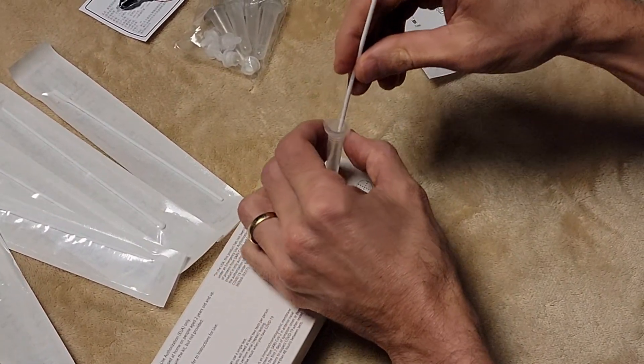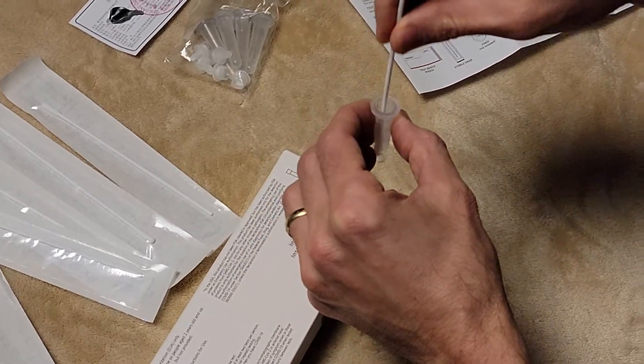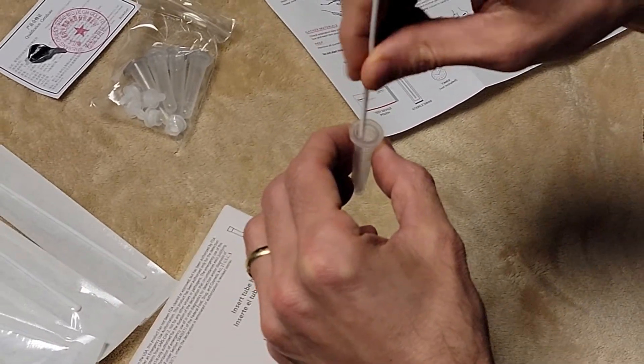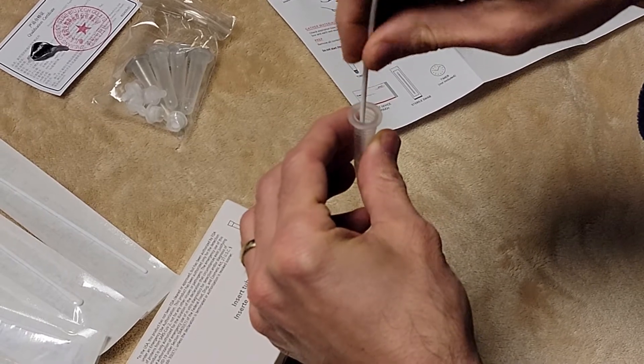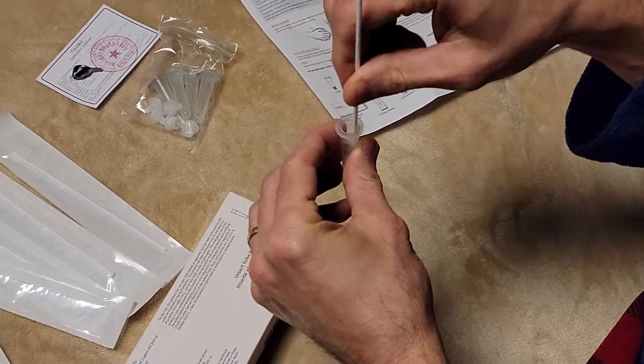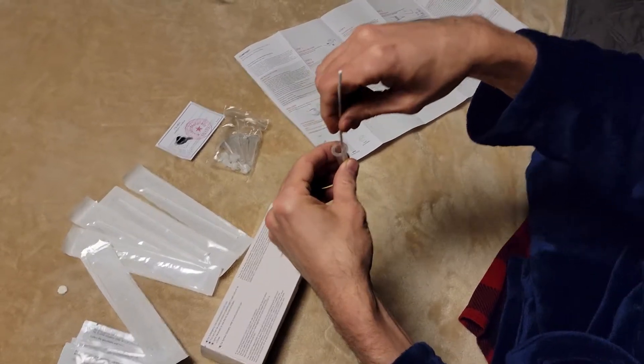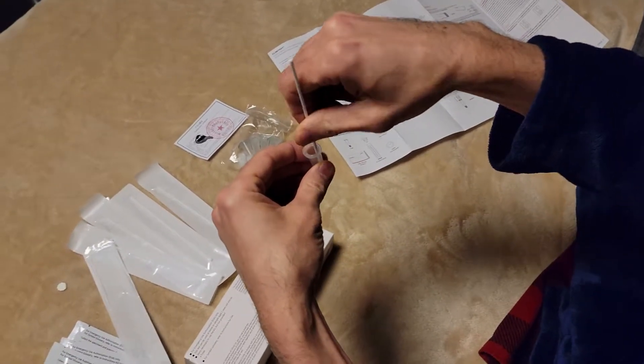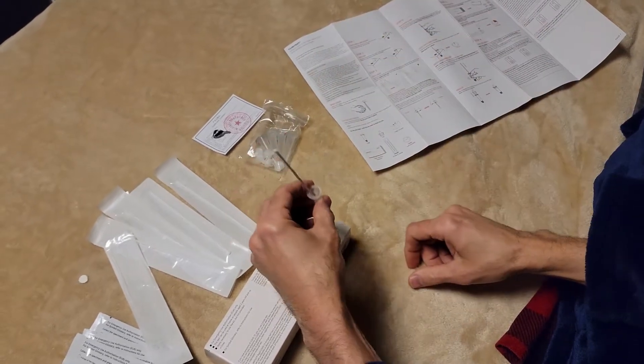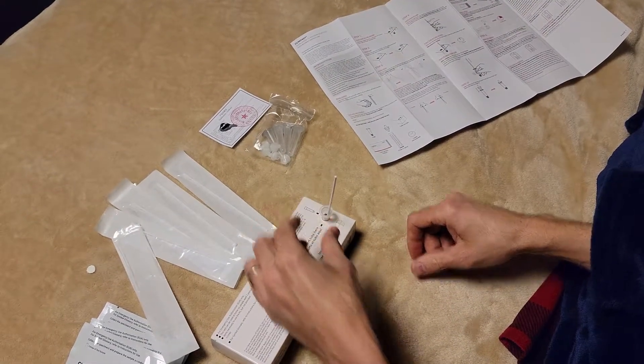It says to take this out and mix it vigorously by rolling the swab tip at least six times on the bottom and the sides of the tube. Okay, so that's quite a few times there. Rubbing vigorously, and then we put it back in there.